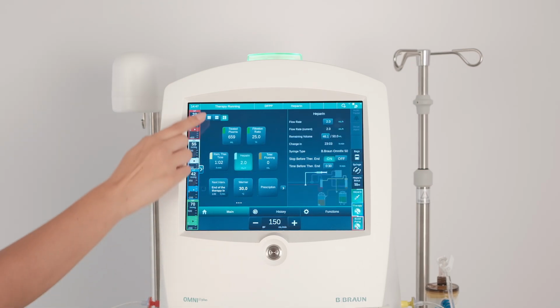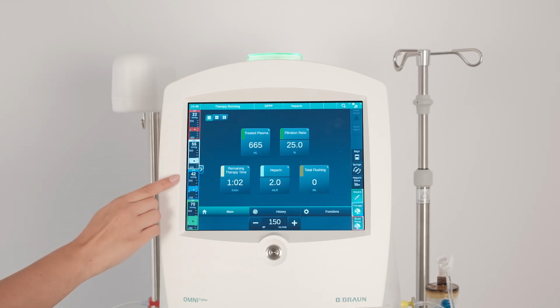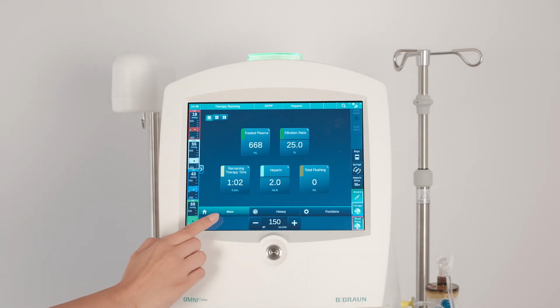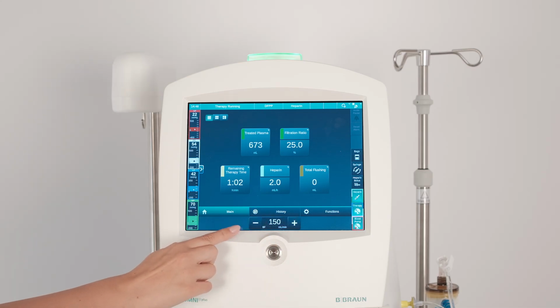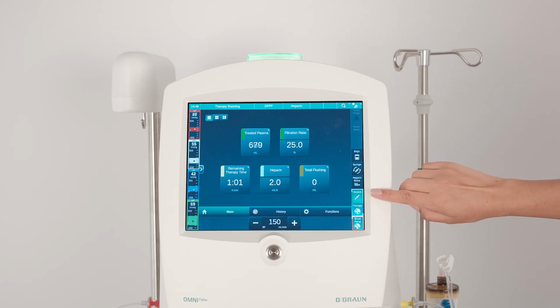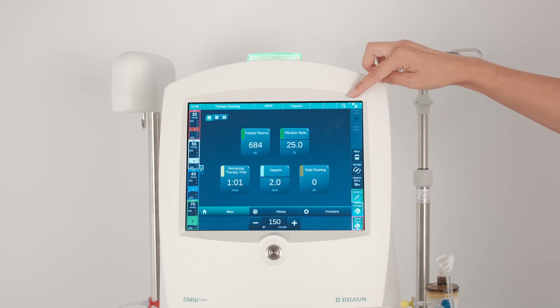The key areas highlighted on the frame of the screen from the left to the right side are Pressures Overview, AP, FP, VP, SP. Menu bar at the bottom, Main, History, Functions. Blood flow. Key icons: blood pump, therapy, heparin, bolus, syringe change, bag change. Other settings.